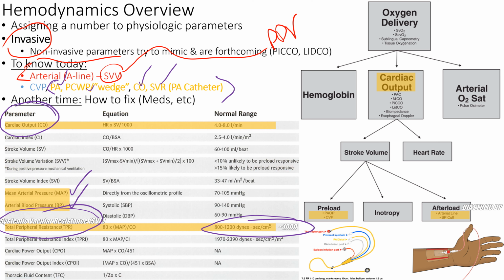And then, of course, lastly, we have the CVP. CVP is grabbed from your triple lumen catheter traditionally, but you can also get it off your PA catheter. Your PA catheter has many ports, and that's just a basic port that's being passed around right now. That's just your baby swan. But there's big swans that even have pacers in it, and a VIP port for the VIPs in the room, a venous infusion port for the RNs. So there's multiple different things that can be added to this one. And continuous cardiac output can be added to it as well.